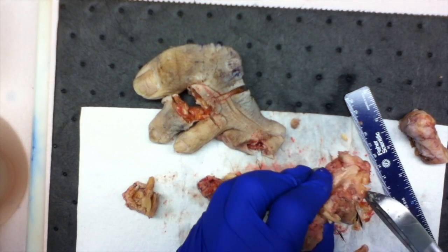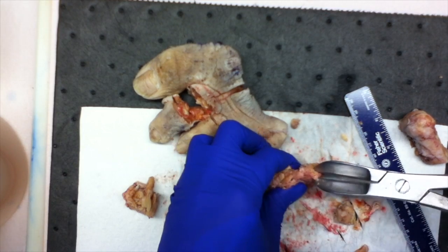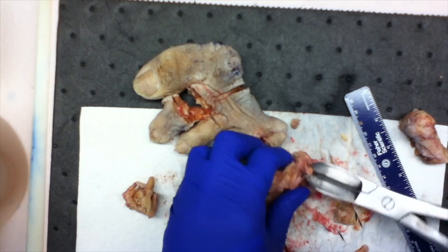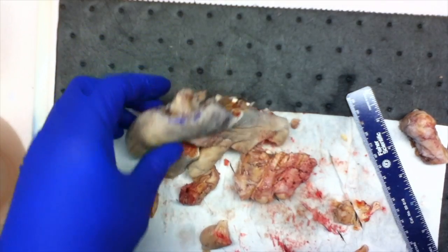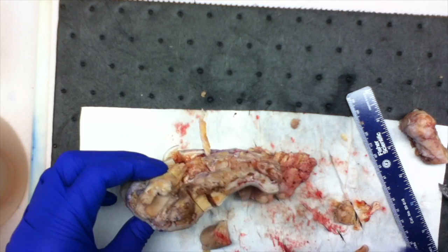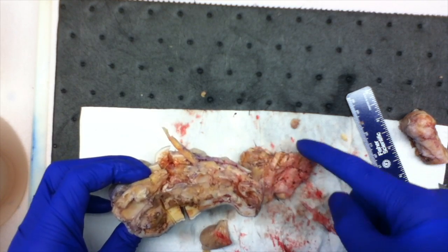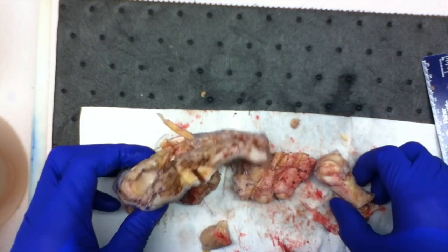Even though we took from the phalange, we're going to take the metatarsal bone because that's the actual bone margin for this resection. We could take the site from the articular surface of the metatarsal joining with the phalange bone, but this is the true margin where this was touching patient. So this is actually a true margin.